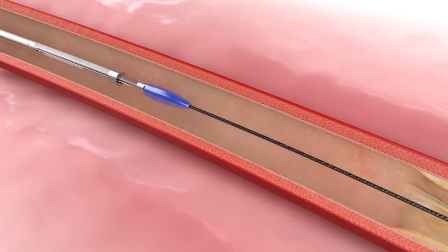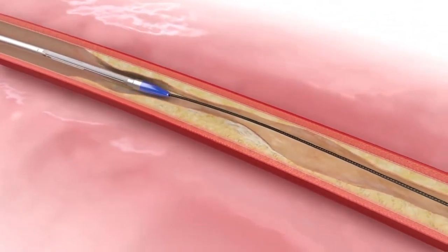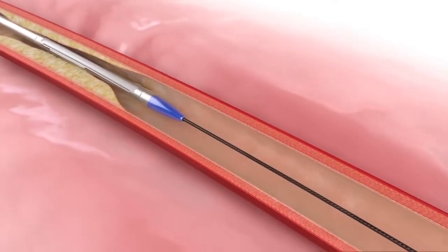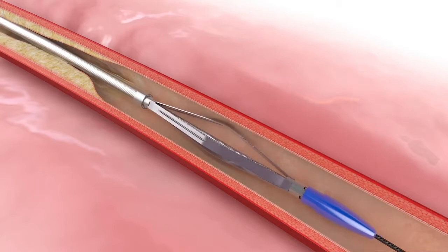Deactivate and resheath Flex and advance back through the treatment area. Rotate Flex 30 to 90 degrees per operator's preference. Unsheath, with the vessel prep element expanded, and perform a second pullback.